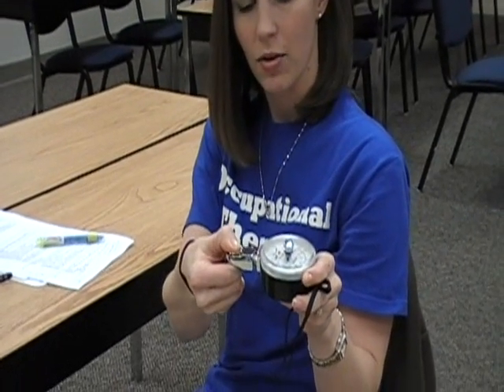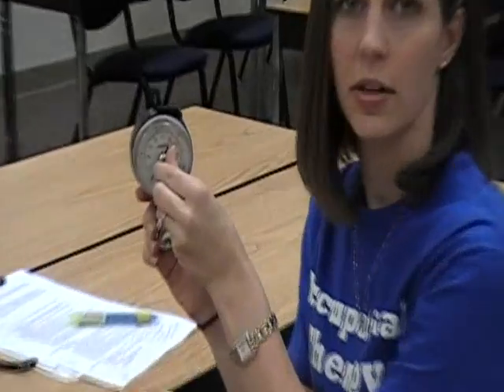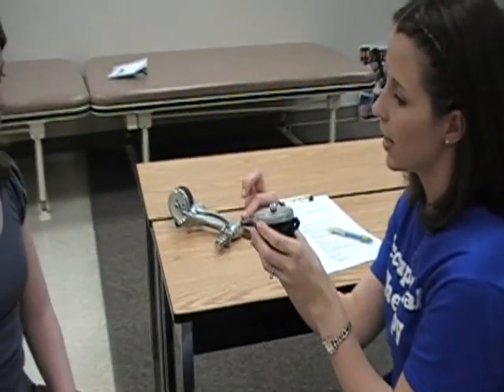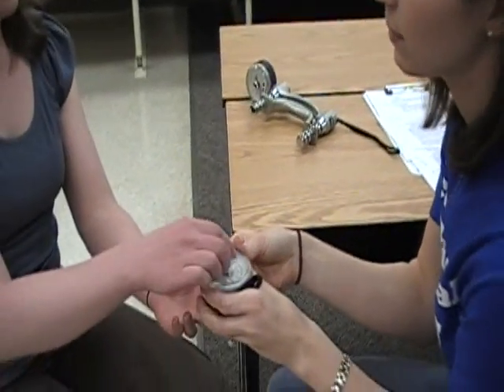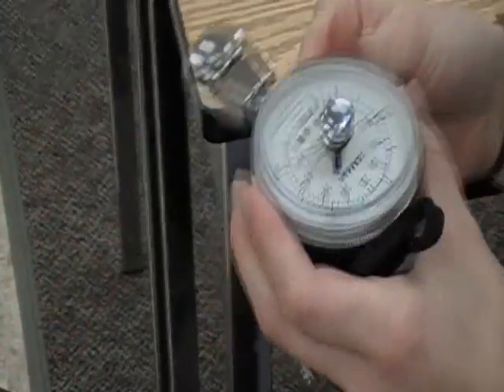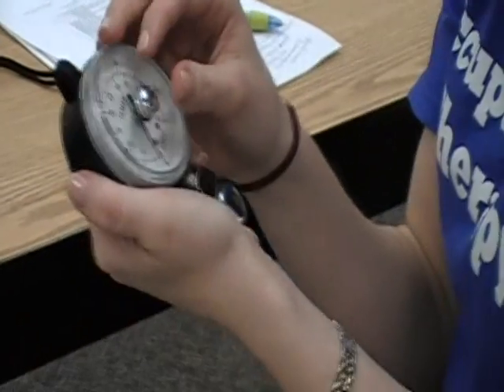Next we're going to test your pinch strength. We'll do two different types of pinch: pulp to pulp, lateral pinch, and tip to tip. Again, make sure the bar is turned to zero. Ms. Rachel Craft, take your thumb and index finger and squeeze as hard as you can. You would record this data and do two more trials and take an average.